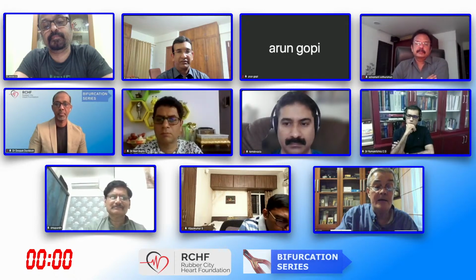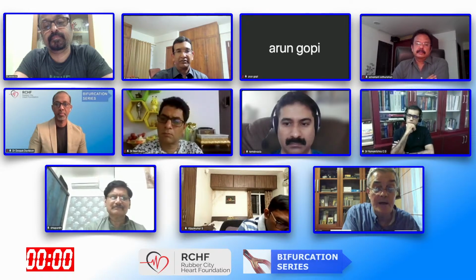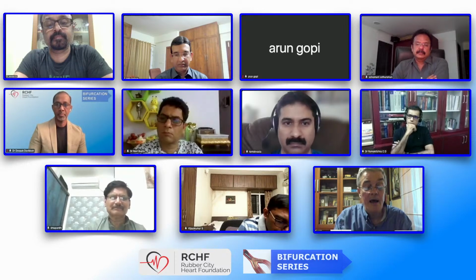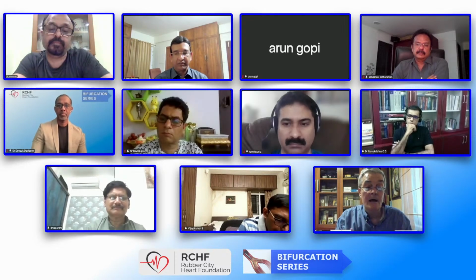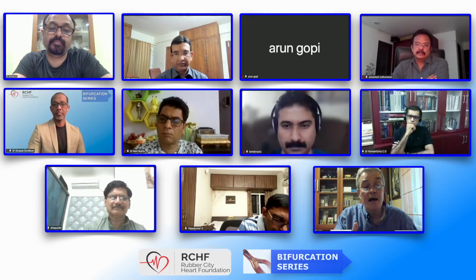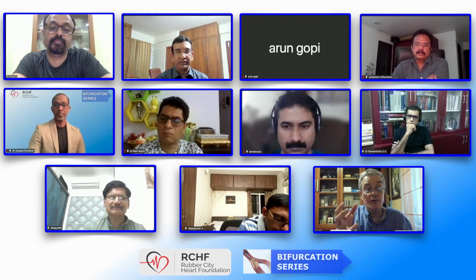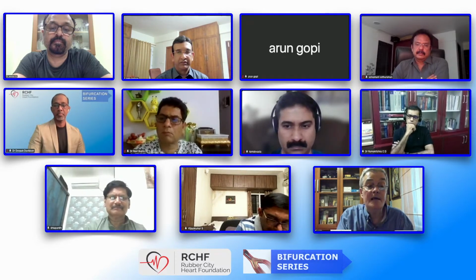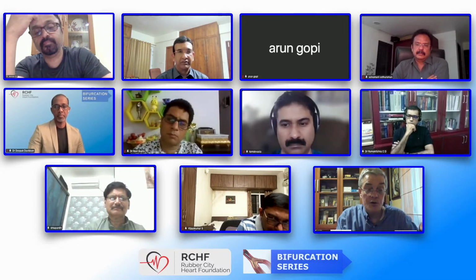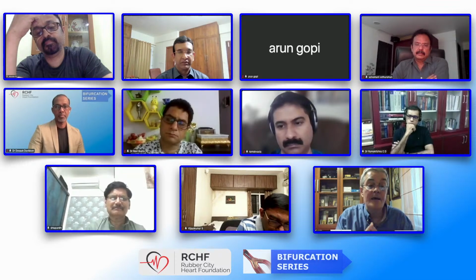So the rate of recrossing and successful final kissing with mini crush was slightly inferior compared to double kiss crush. And this is the main reason. If you are sure that you will finish the procedure with kissing, then after having kissing, the comparison of kissing with mini and DK crush should not give you a difference in outcome. But if you don't kiss in mini crush, this should probably increase the potential risk for events.